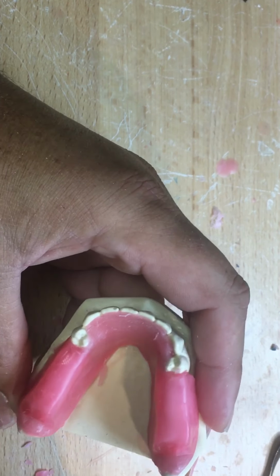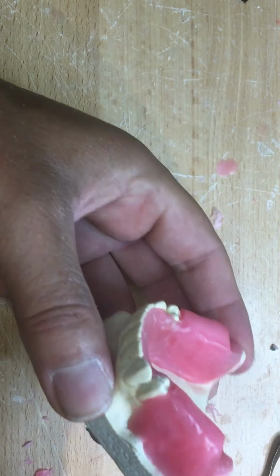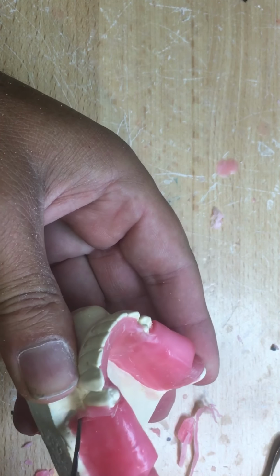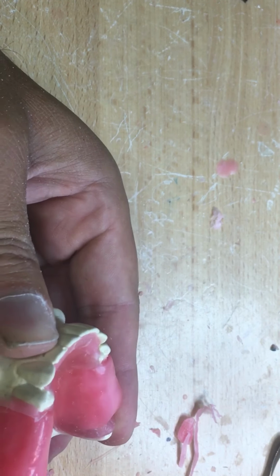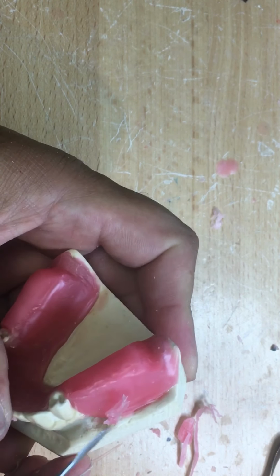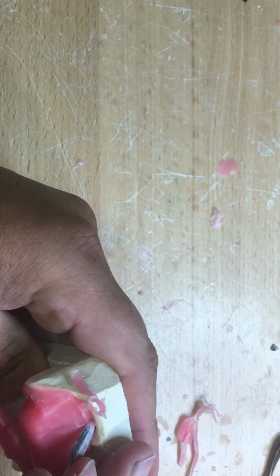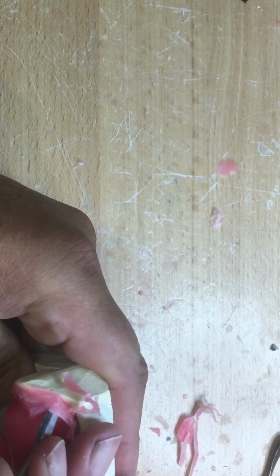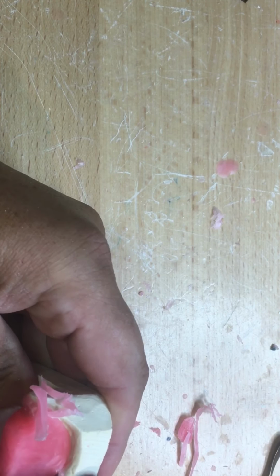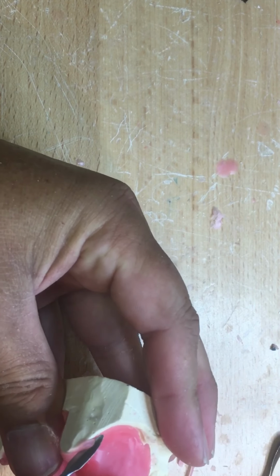Yeah, so the skills here in waxing up the occlusion rim are the same transferable skills of waxing the festooning of the denture, the same transferable skills in a full denture, the same transferable skills if the medium happens to be acrylic or inlay wax or light cure. It doesn't matter what the material or the medium is, we adapt, and we should be able to create any scenario with any product. And I think that's the biggest learning curve in dental technology, when materials change.